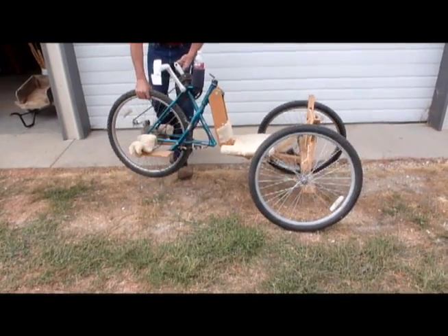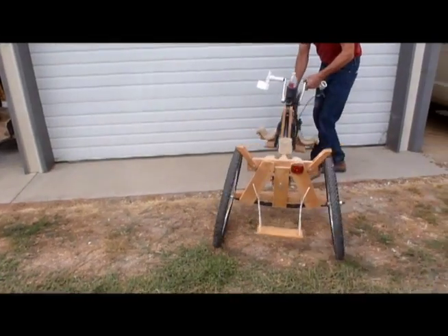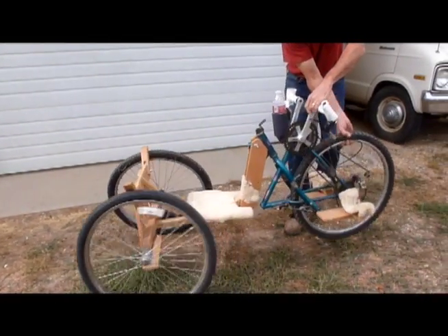Here is a 360-degree view of the OBOW-R to help in your construction. More pictures and details are available on our website.